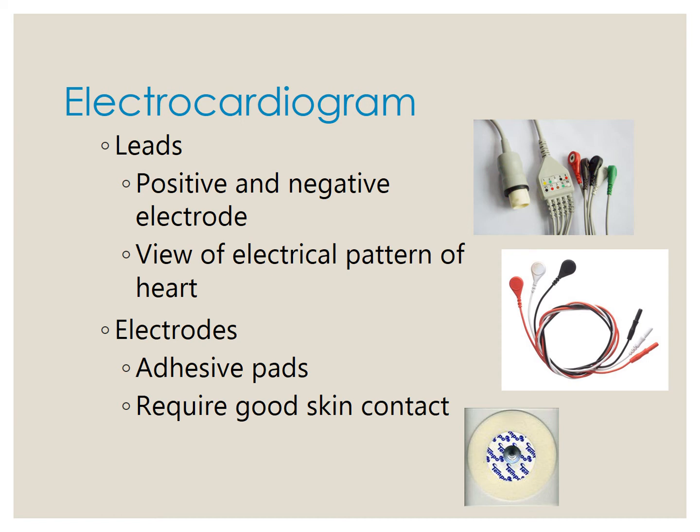It may seem like a hassle at the moment, but you're going to have more of a hassle trying to get those leads to conduct and to give you a good rhythm if you try to go the fast way and just put them on top of this hairy chest. Okay, I'm done with that.